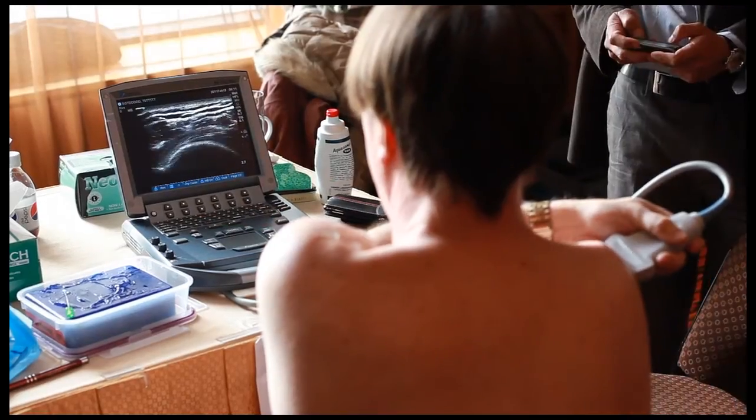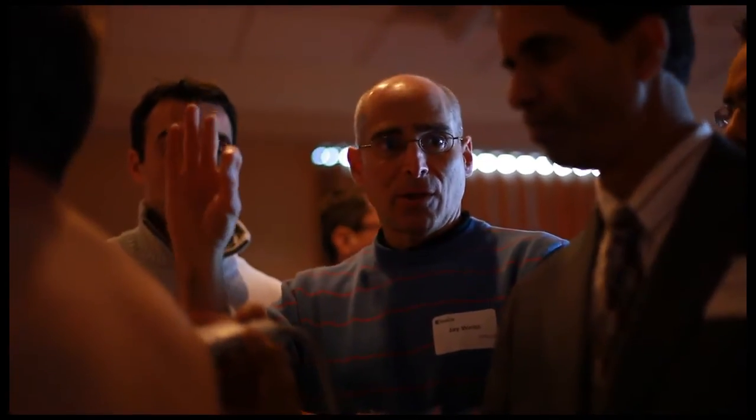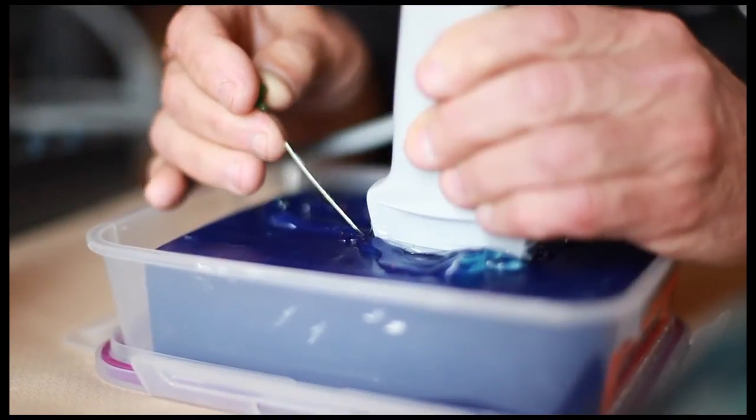It's not 100% comprehensive, but it's probably the best single short-term way to orient yourself to ultrasound. I think you have to do something like this if you're considering it, because reading about it is not sufficient. You have to actually expose yourself to it and be instructed by someone who knows what they're doing.